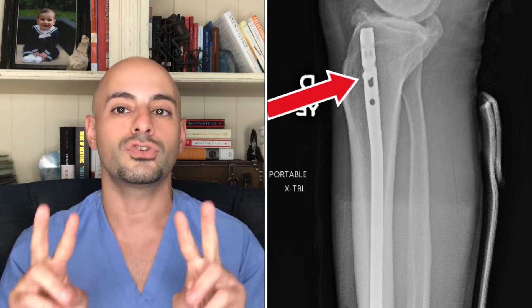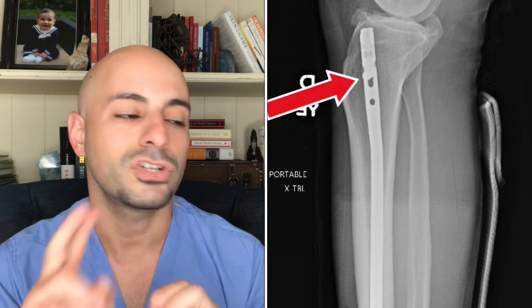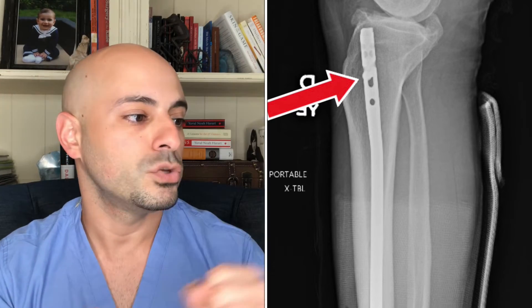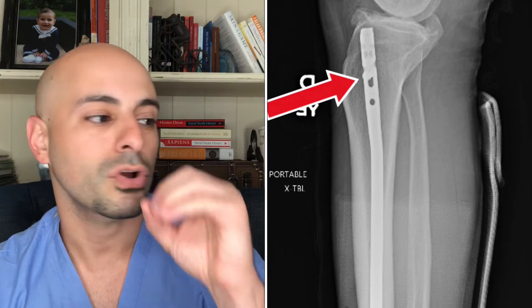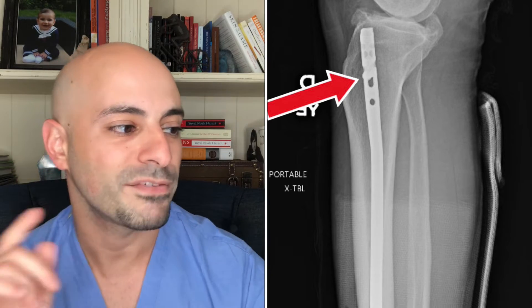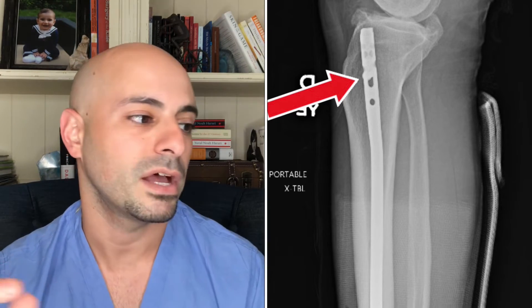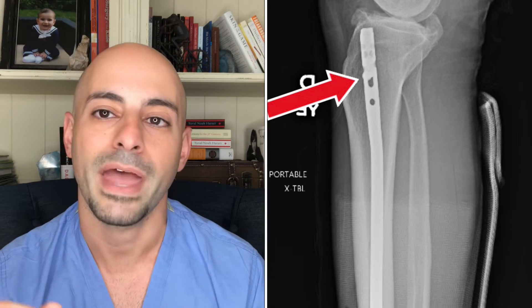You can see there's only one screw there. Typically we place two screws up there. Pay attention to what the holes look like — the hole that the screw is actually in. You can see the one on the bottom is a circle and the one on top is an oval. They've placed the screw through the oval, which means they want to dynamize the nail — we'll talk through what that means in a second.